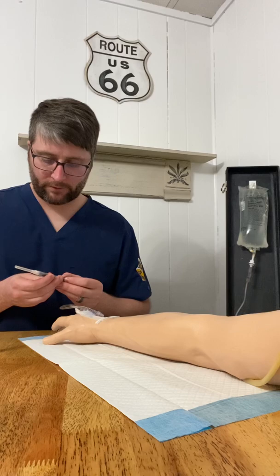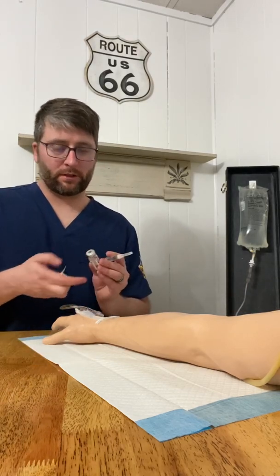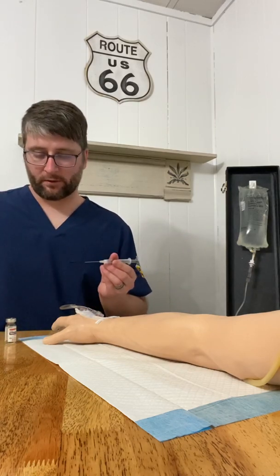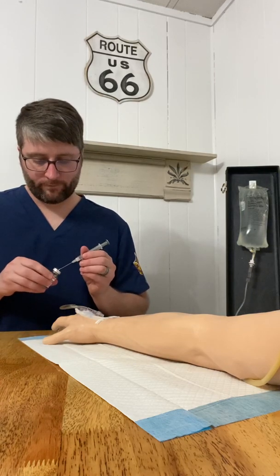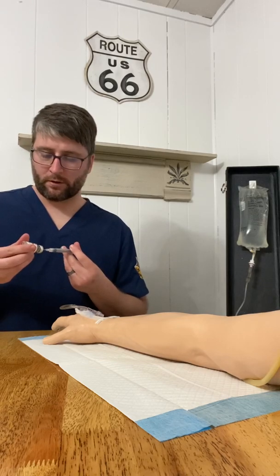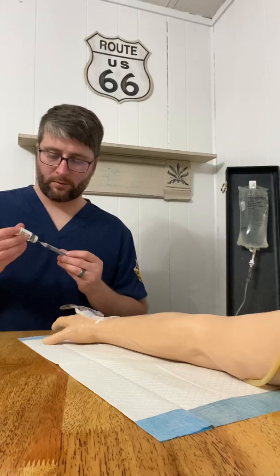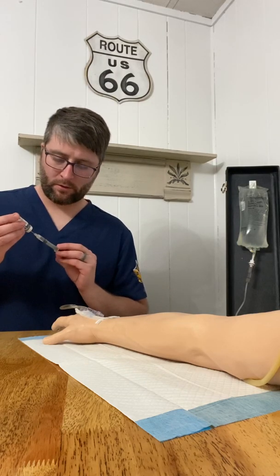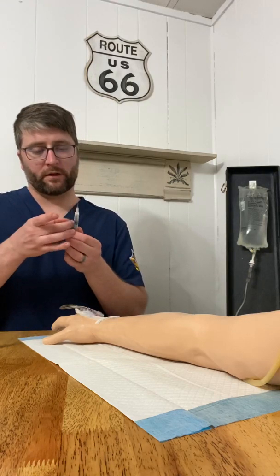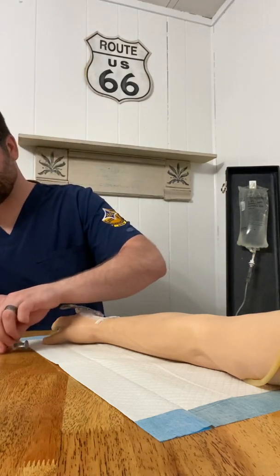So I'm going to pre-fill the syringe. I'm also going to take my alcohol swab here, disinfect the top of this multi-use vial. I am now going to get in here, come in sideways, and then go. All right, inject the 1 ml, and then we are coming back out with our 1 ml. Okay, and then flick our bubbles to the top. Got that. Use our one-handed scoop technique to do that.